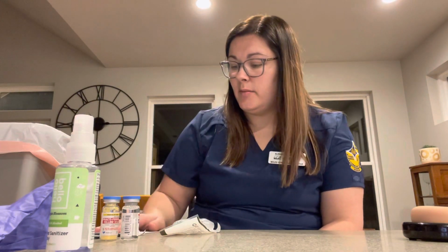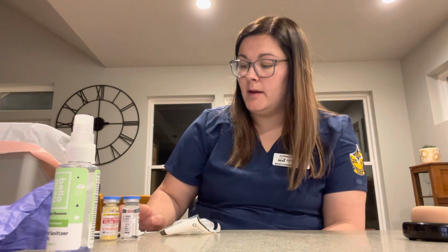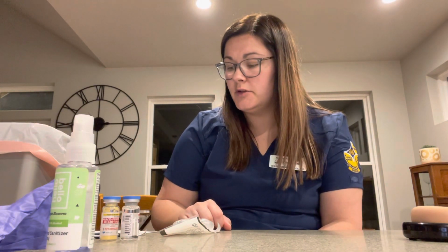I will start by checking my MAR. It's Rocephin 1 gram IM every 12 hours for 6 days. I will have to reconstitute and calculate the dosage, and then it will be a Z-track for administration.